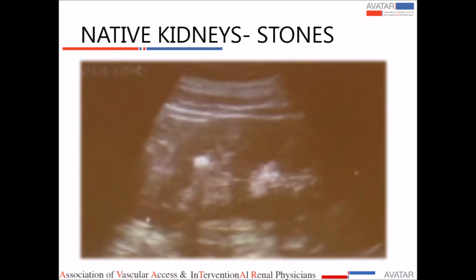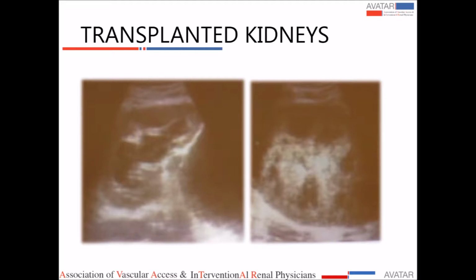And then if you have a patient that presents with pain, with hematuria, and you do the ultrasound and you see this echogenic focus, and you see a shadow that comes behind it, this is possibly a kidney stone. This acoustic shadowing is very important. Sometimes you may just see minor calcifications without the acoustic shadow as well, but this is obviously nephrolithiasis.